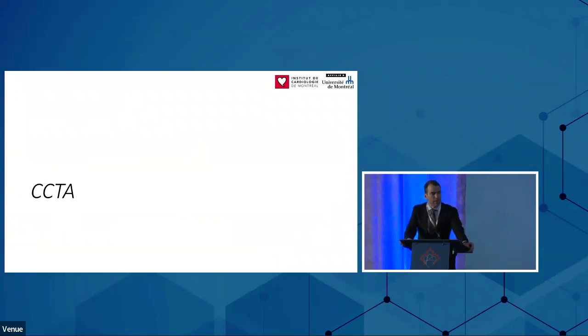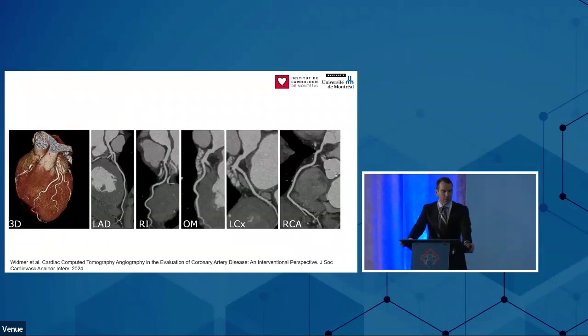The second big challenge we're facing is coronary CT angiography. I just picked a random image on Google Images to show you how beautiful these images look, right? You're seeing these high resolution pictures, you're seeing the coronary arteries, and you're comparing that to a blurry SPECT perfusion with your 1 centimeter spatial resolution, and how can we compete with that, right?